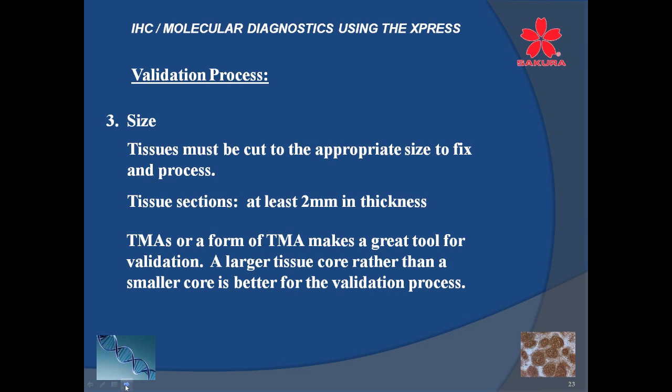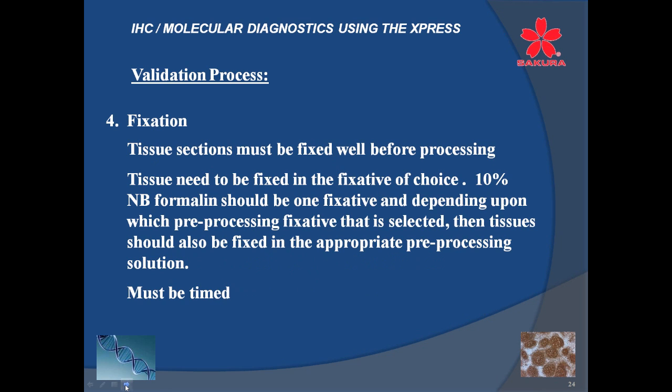Because in doing so, you can use positive and negative together. You can have maybe high expressor, low expressor, in between expressions. That will give you a nice array of validation. No pun intended there.